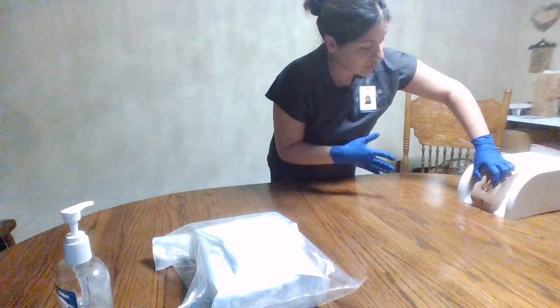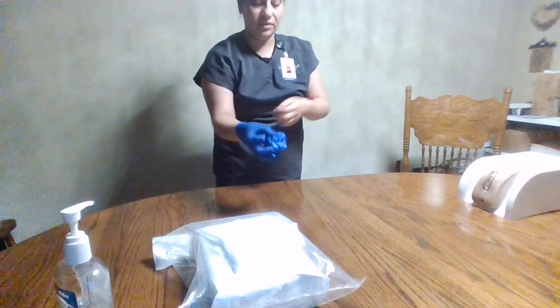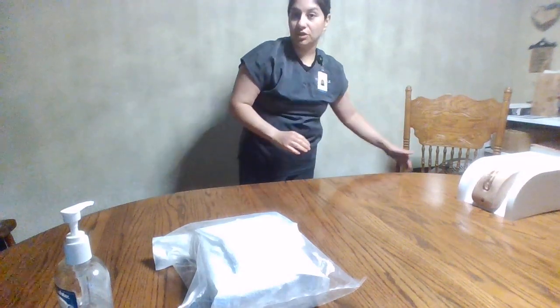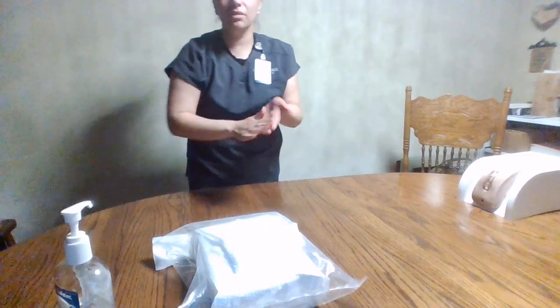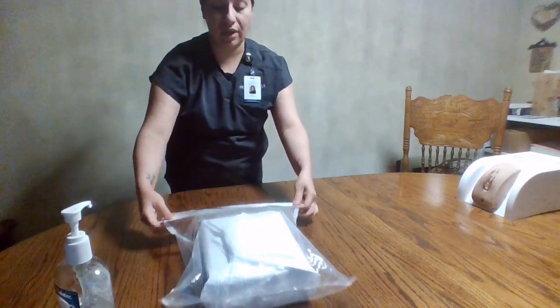Okay, so it looks like everything's good. So I will dispose of my gloves and toss those in the trash. I will make sure to perform hand hygiene. And at this time, I will open the Foley catheter kit.